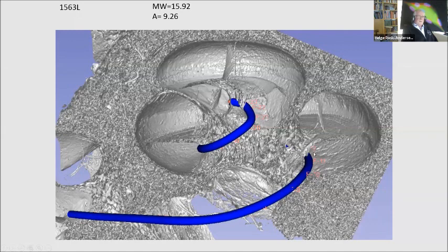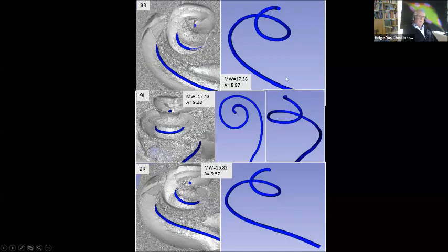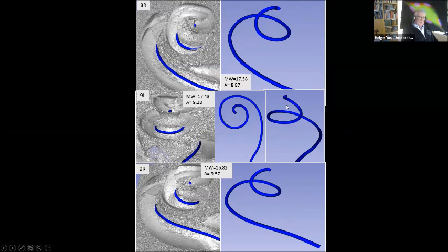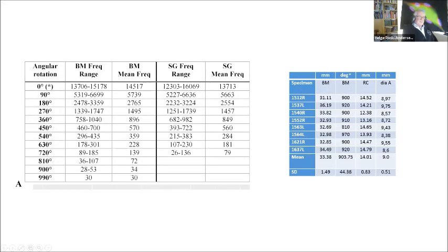So looking at the perimodiolar space, and we follow them, we can see that this is actually the shape of the spiral ganglion in humans. So it goes up about 2 turns, 1 3/4, 2 turns. And so this is a way, if you want to stimulate the spiral ganglion cells directly through the perimodiolar, we should shape it like this to get the optimal stimulation.